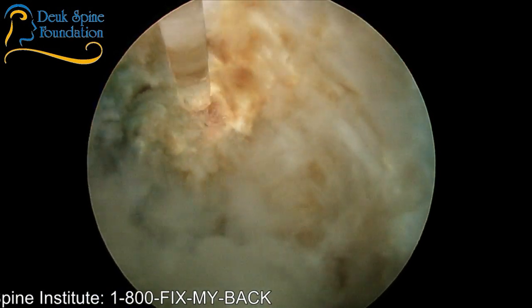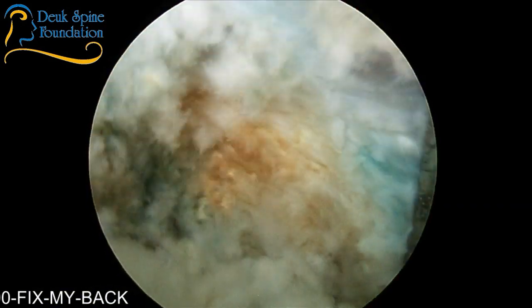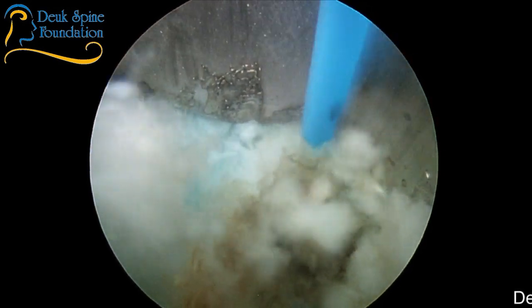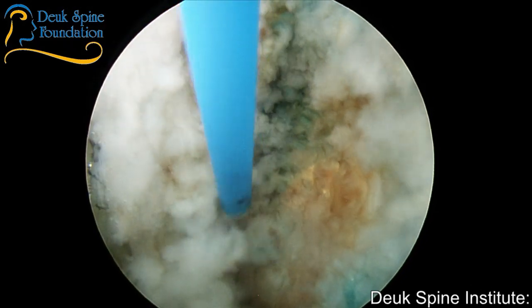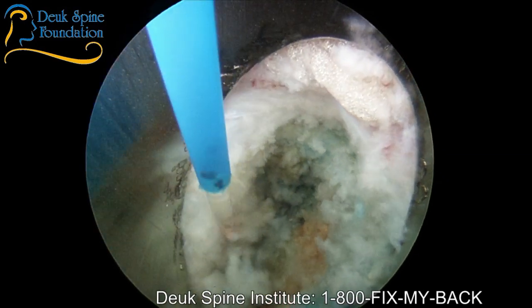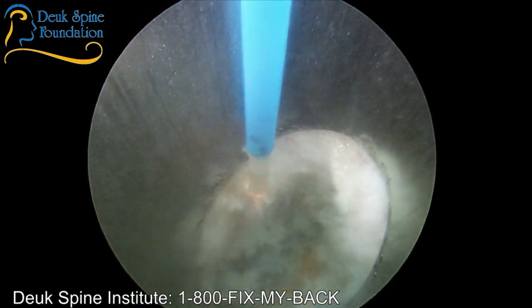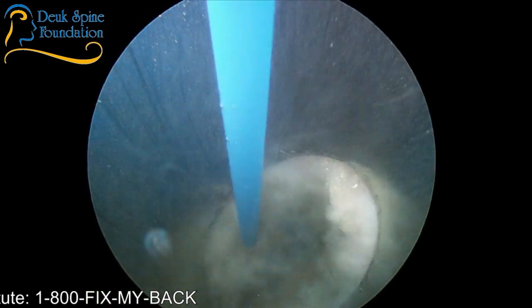And the golden color you're seeing is calcium, calcification. So remember, your inflammatory response to chronic inflammation is to make collagen, or scar tissue, and then to also calcify it. A lot of people don't know to do that lateral component. But the patient will know if you don't do it. They'll wake up and they'll still have leg pain. And you don't want that. These people travel far. They put their lives on hold. They take huge risks just to have surgery. They deserve to get the very best.